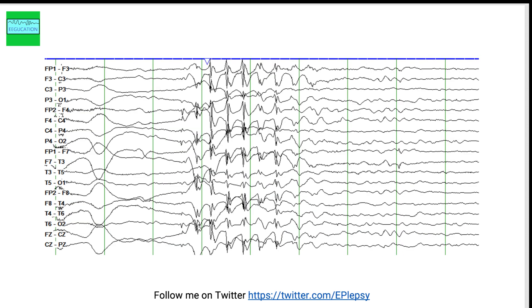This is a different patient. On the EEG you see generalized spike and wave discharges at a frequency of three spike and wave discharges per second. As you can see from the rest of the EEG, the patient is asleep. When you see generalized spike and wave and poly spike and wave discharges on the EEG, you suspect an association with generalized epilepsy.